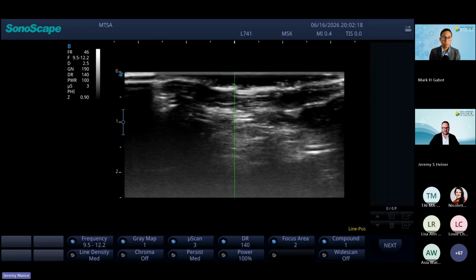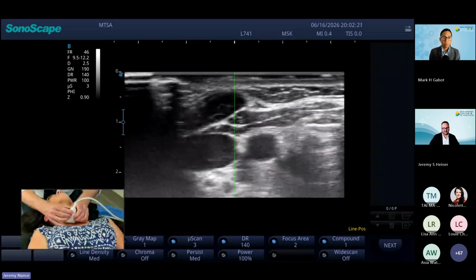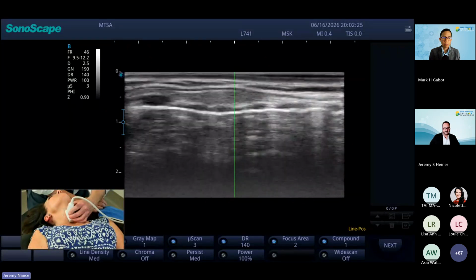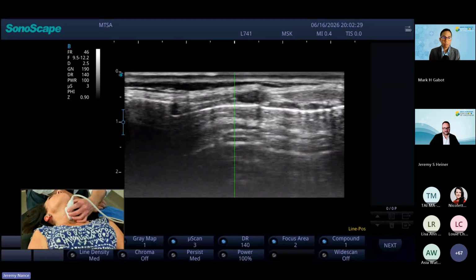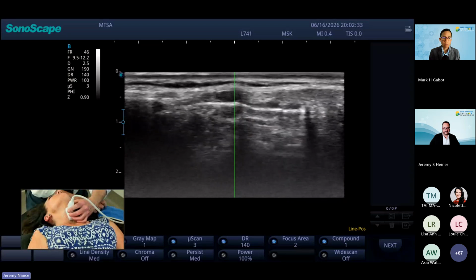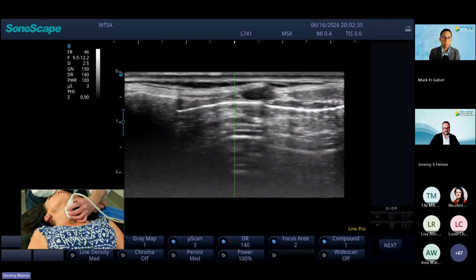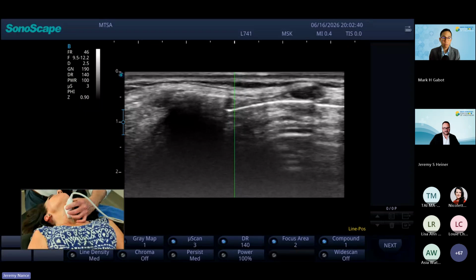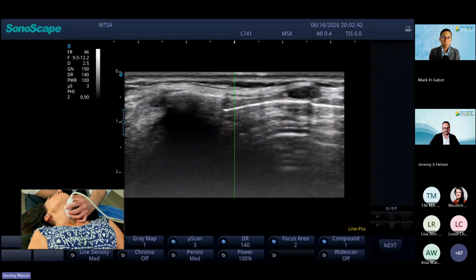I would probably use a center line. I would come and find my string of pearls. I would scan proximal. Once I got to the inferior border at the center line, I would draw a line knowing where my inferior border is. I would then continue cephalad to my superior border and then draw another line at the midline of the transducer.